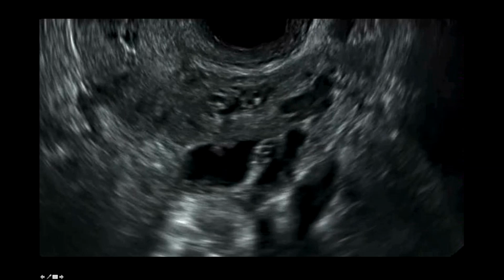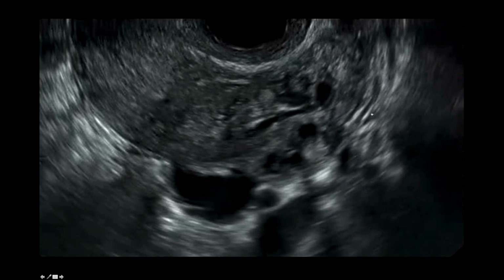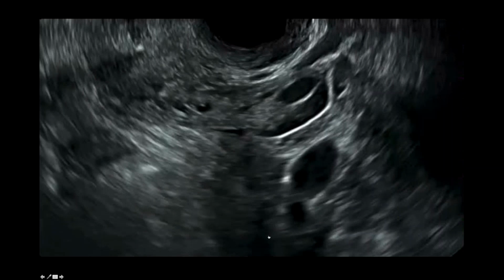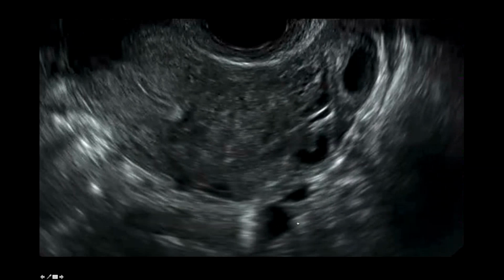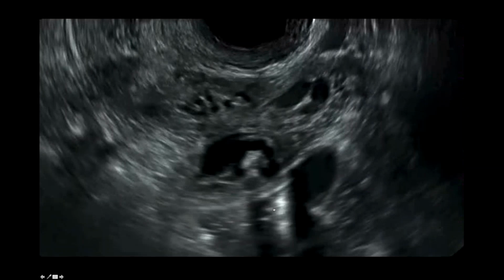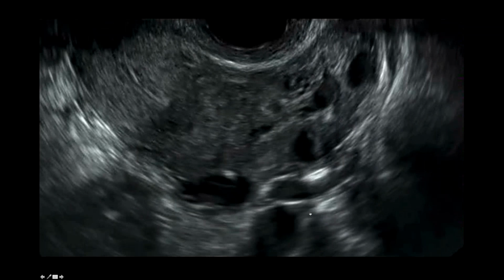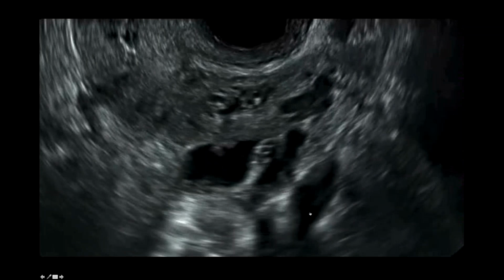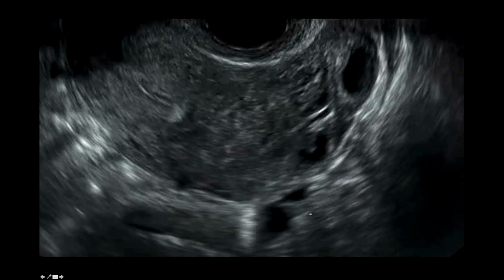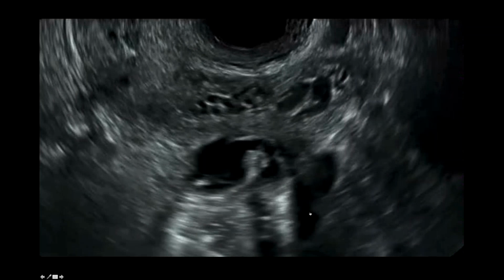Okay, so here's an actual clip from a patient. Here is the left ovary you're going to see, and down here, you're going to see this tubular collection. And that's how a hydrosalpinx would look if you were actually scanning it live and moving your probe from side to side. So ultrasound is a very dynamic exam. It's very difficult to be able to perform an optimal ultrasound exam if you're reading still images because you're limited to the images that are being sent to you.